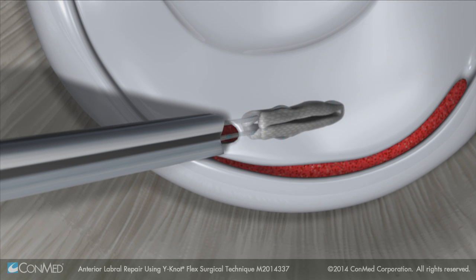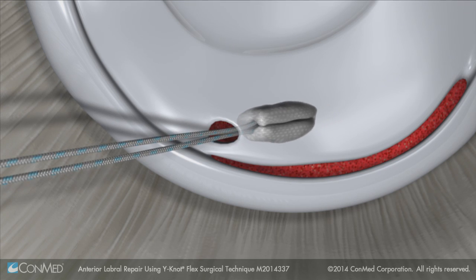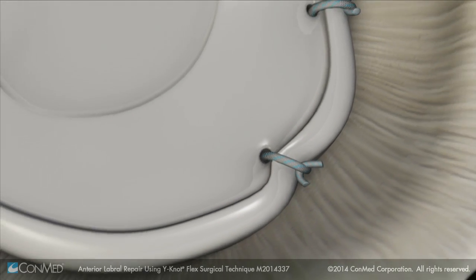Place the anchor and pull back to deploy. Repeat the steps using additional anchors to complete the repair.